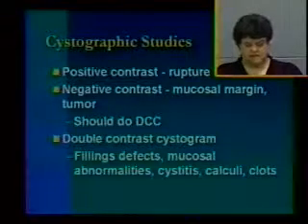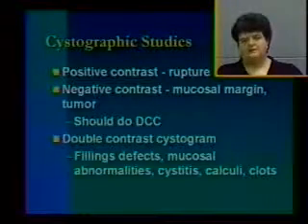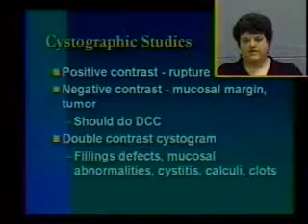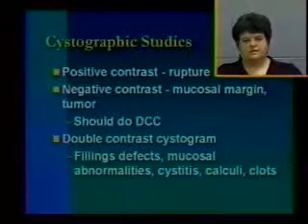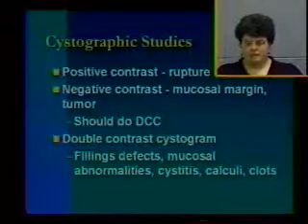So double contrast cystograms are very useful for filling defects, mucosal abnormalities, urinary bladder infections, cystitis, identifying non-radio-opaque calculi, and blood clots.